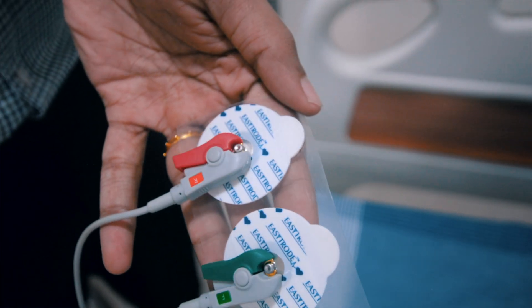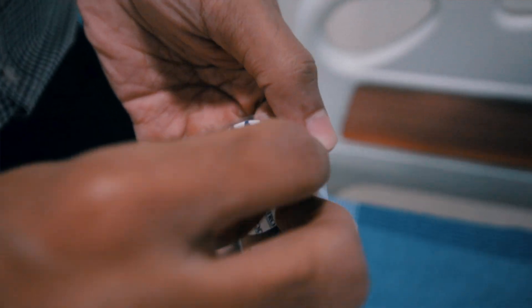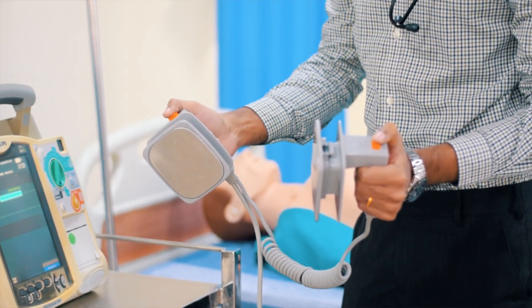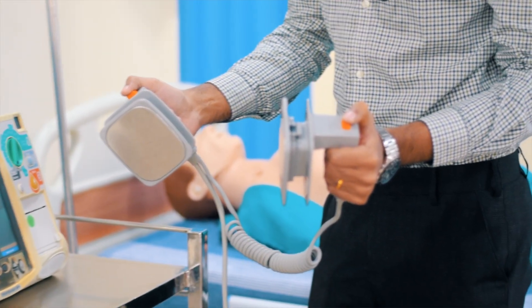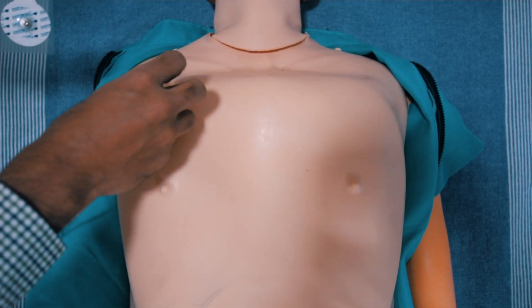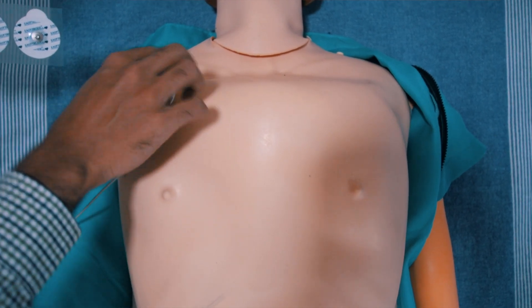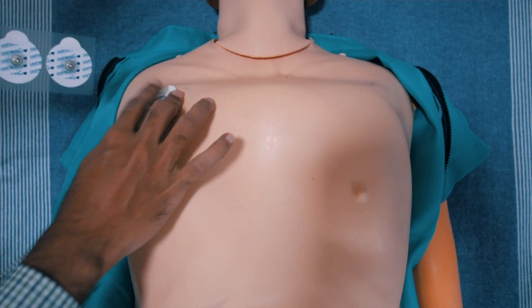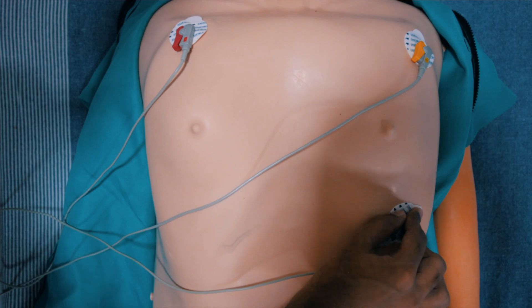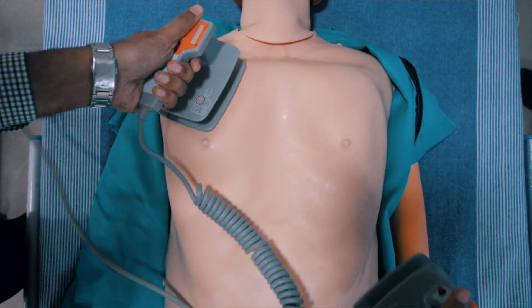For rhythm analysis, you can either use the cardiac leads or the external paddles. If you're using the cardiac leads, place the red lead over the right shoulder, yellow over the left shoulder, and green below the apex.